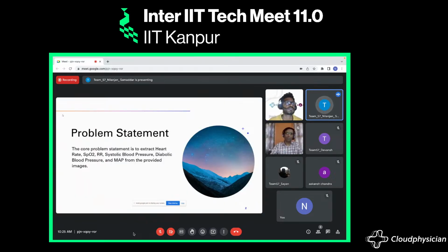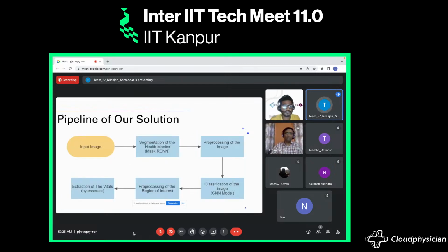The problem statement was to extract the vitals from the image, like the heart rate, SpO2, systolic blood pressure, etc. This is the pipeline of our solution. The pipeline was to first segment out the region of interest, that is the screen of the monitor, then pre-process the image. Further, we would classify the image using a CNN model. We would then pre-process the region of interest and extract the vitals using the PyTesseract library.